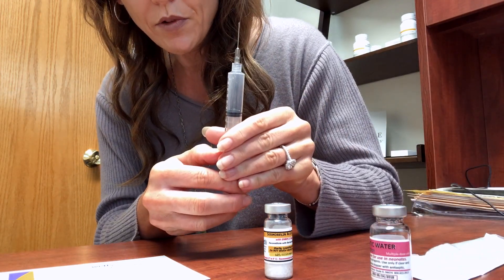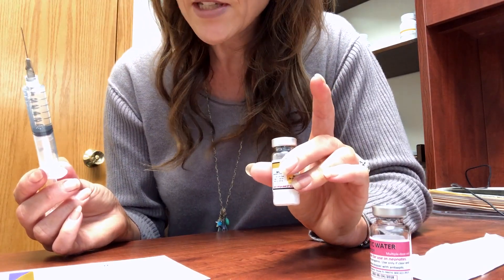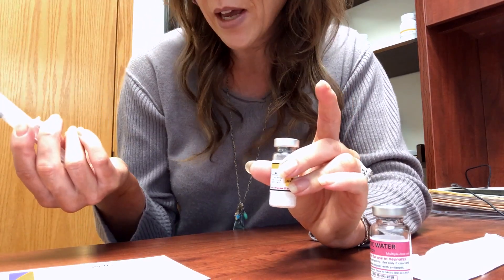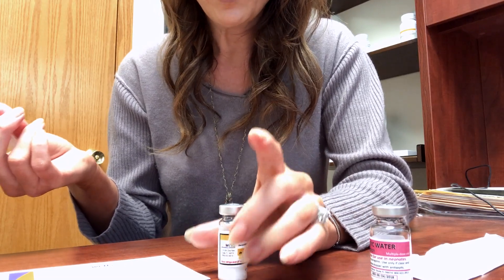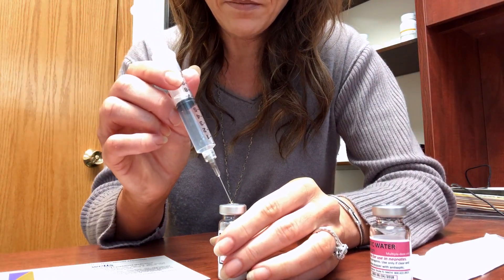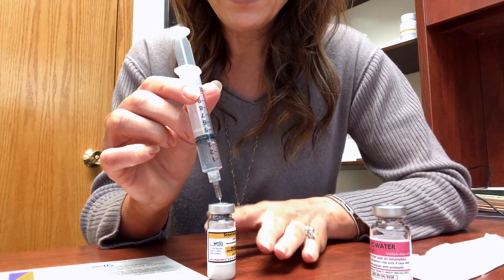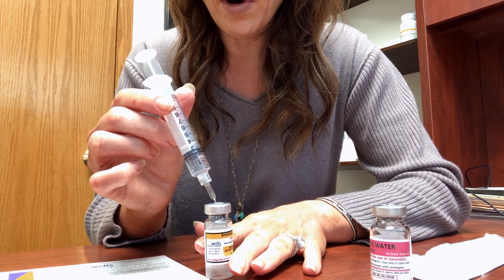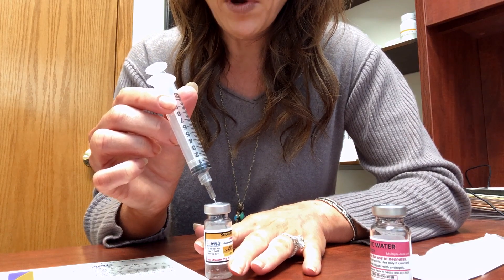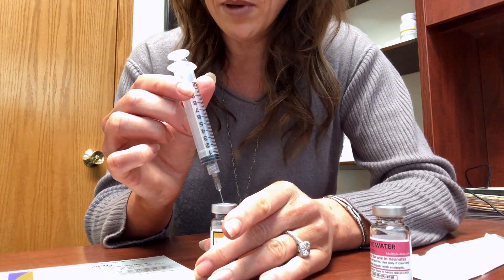You can tap out those air bubbles if you need to. The Sermorelin itself contains a vacuum inside the vial, so what you'll do is just insert the needle in the top and you don't need to do anything — it's just going to suck that water right in. It's a good idea to point that needle at the side of the vial just so that you don't get a bunch of bubbles.